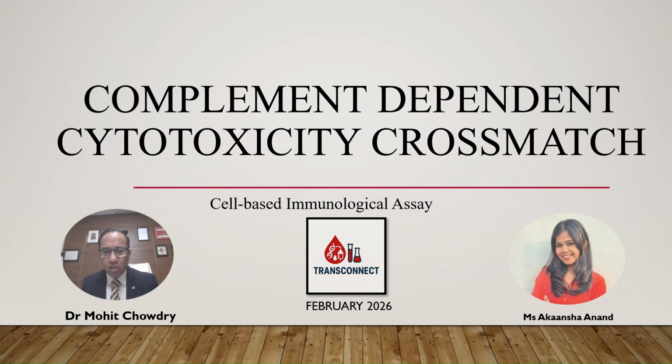The various modifications are if we can extend the incubation time, increase the temperature, increase the washing step, and most importantly use the anti-human globulin or AHG with it. So this test has got its own perils. It's a very exhaustive test, but then it has got its own advantages, because this is like an in vitro transplant or a mini transplant outside the body.